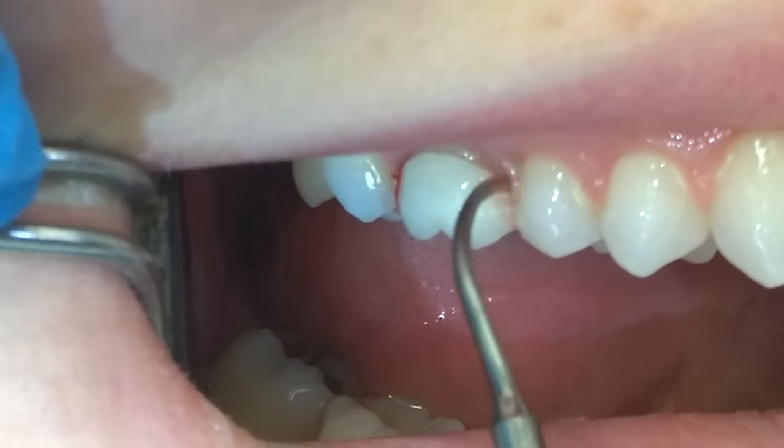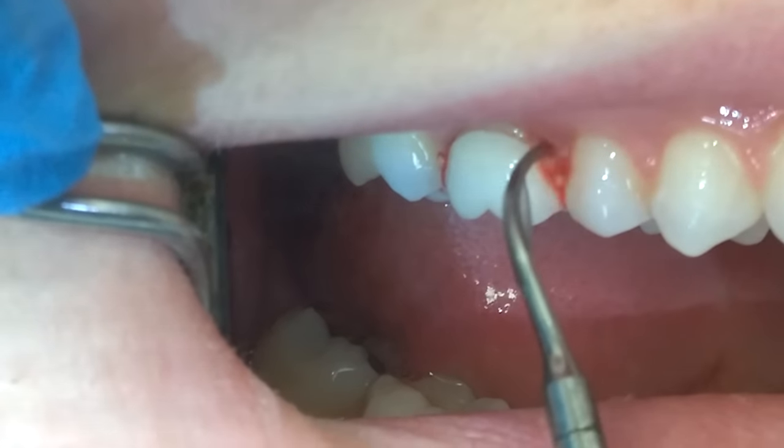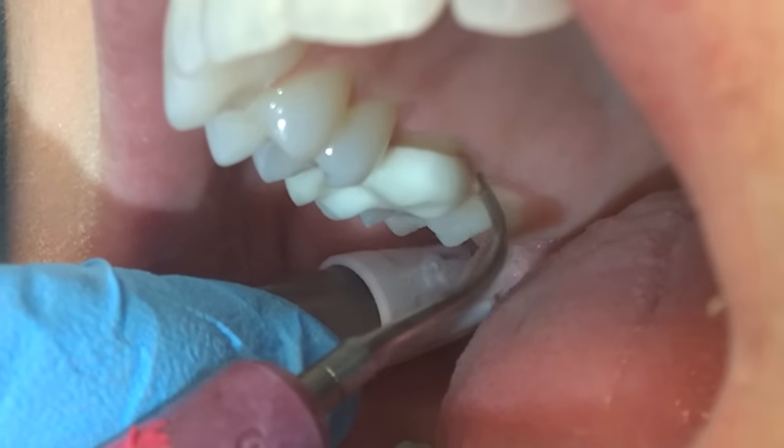Generally, if I see bleeding, I'll stay in the area doing multi-directional exploratory-like strokes for about 20-30 seconds to reduce the bacterial levels.